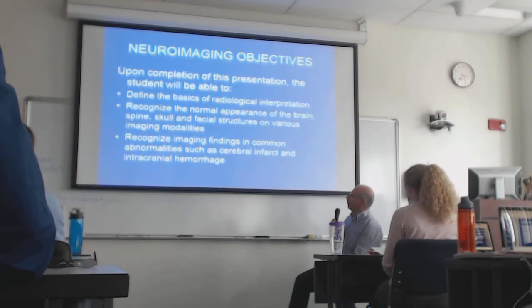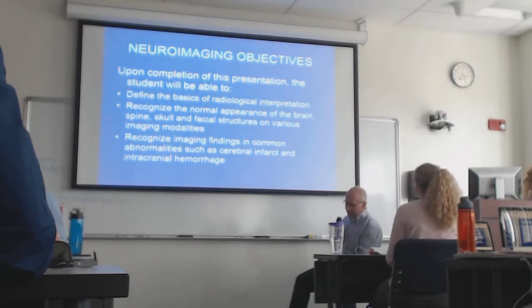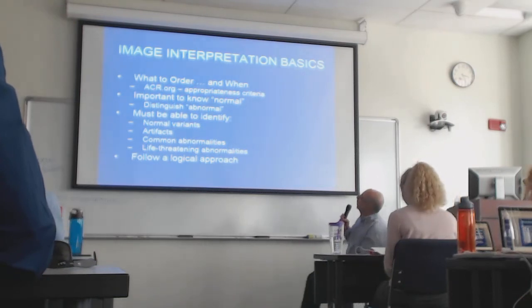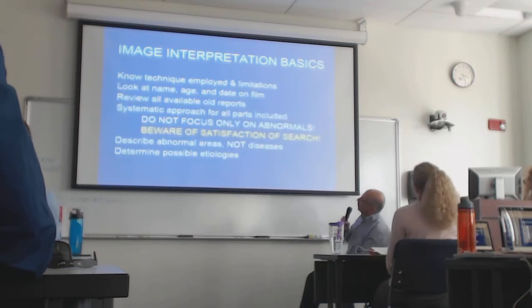So we'll talk about the modalities and the common imaging abnormalities in neuroimaging. Okay, so I think I might have showed you this slide before. You guys don't need to see that. Okay.